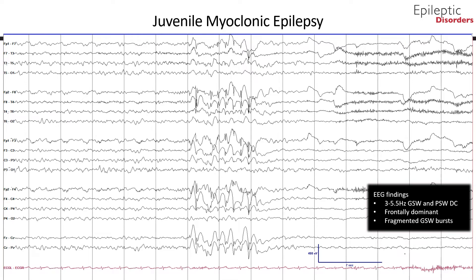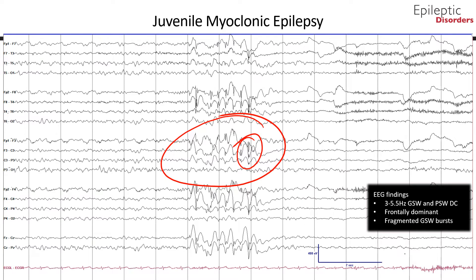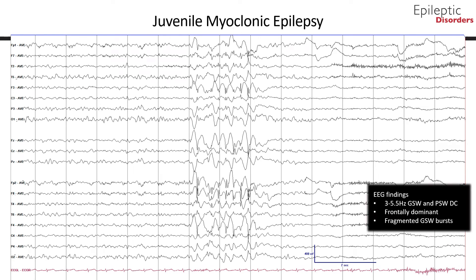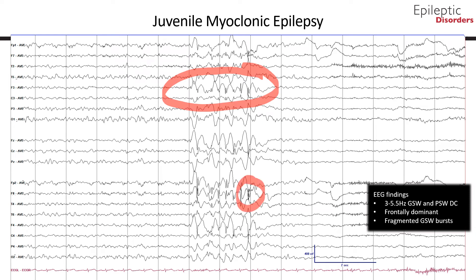In this bipolar montage EEG of a 13-year-old boy, fragmented 3 to 4 Hz generalized spike and poly spike and wave discharges are noted to be maximal over the frontal leads. The average montage of the same patient shows 4 Hz spike and poly spike and wave discharges maximal in amplitude in the frontal leads. Note how some discharges are non-uniform and fragmented, consistent with JME.